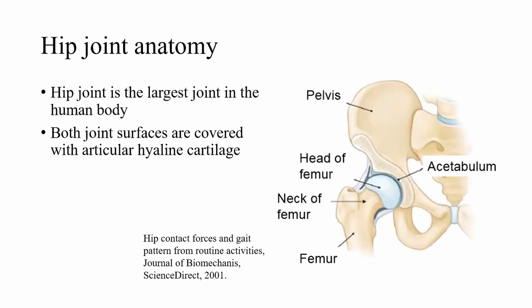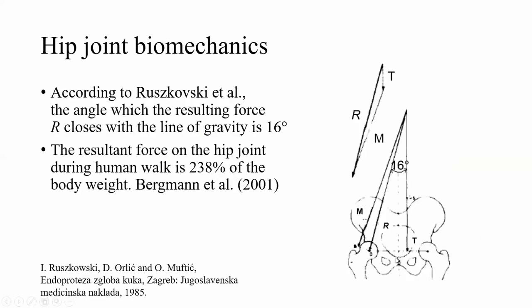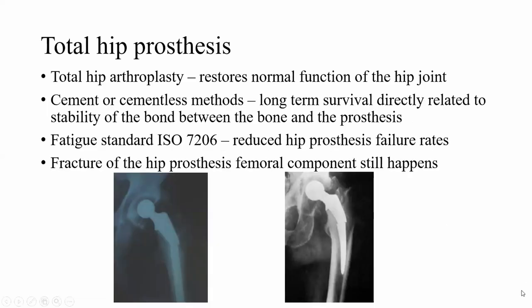Hip joint is the largest joint in the human body. Sometimes it should be replaced by the total hip prosthesis due to disease or accidents. Hip joint enables movement such as extension and flexion, abduction and adduction, and rotation. Hip joint may be heavily loaded. For example, it can be exposed to load as high as 10 body weights. The resultant force on the hip joint during human walk is 238% of the body weight, according to Bergman et al. Total hip arthroplasty restores normal function of the hip joint.